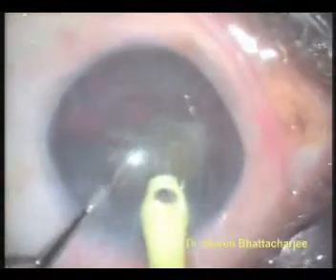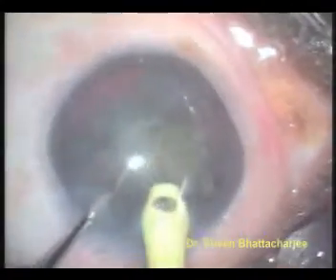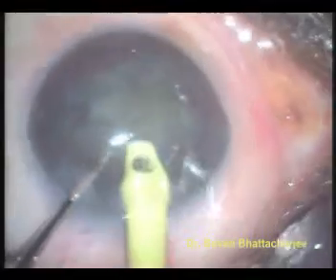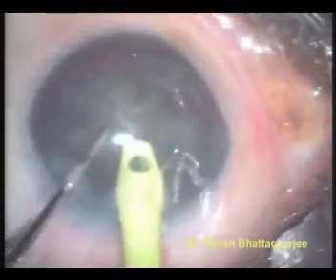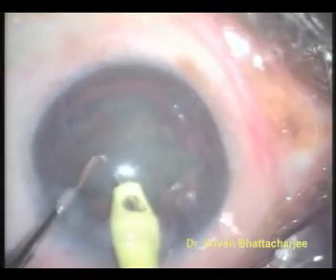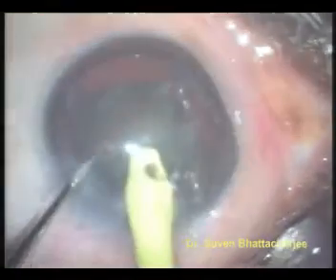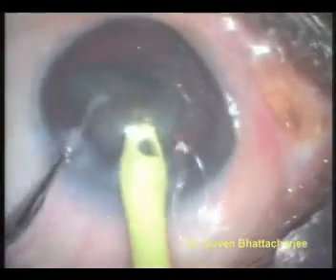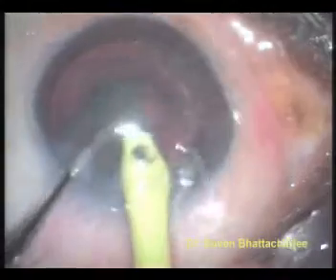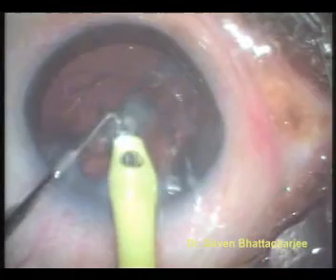While the quadrants are removed one after the other, care needs to be taken that the phaco tip does not damage the posterior capsule, or the transparent peel behind, as this is absolutely necessary for a successful intraocular lens implantation. A damage to the posterior capsule may also lead to a nuclear fragment going through into the vitreous. This is the last of the nuclear fragments being removed.